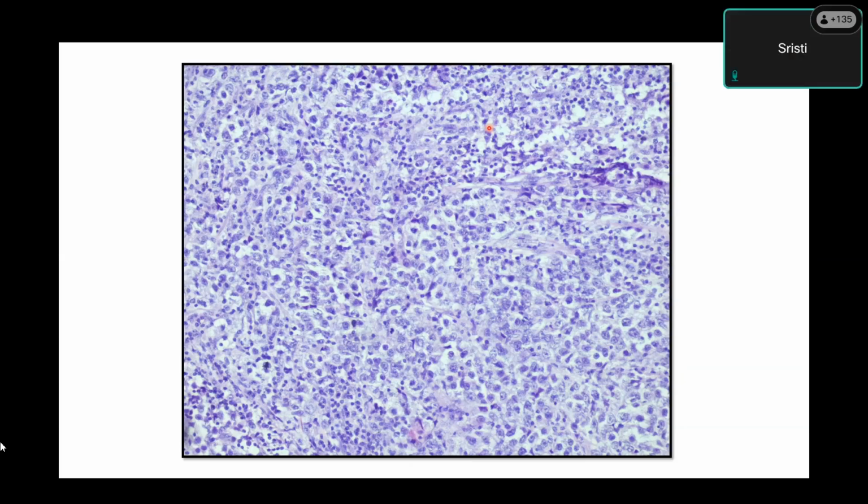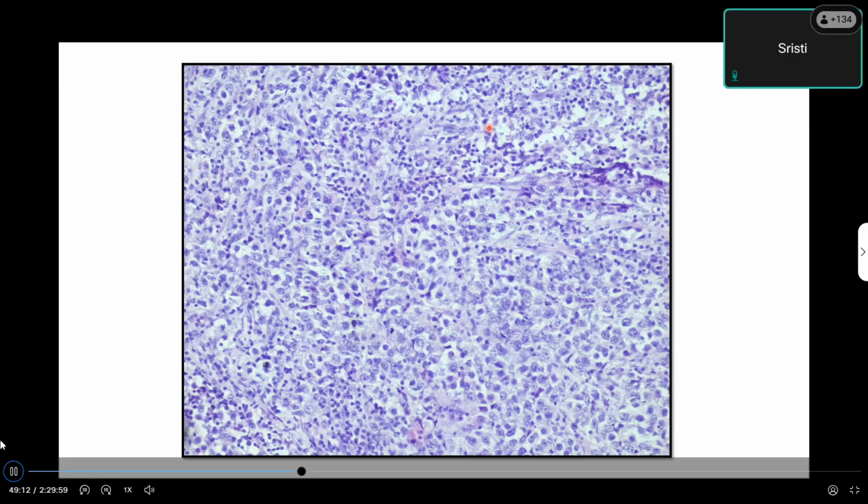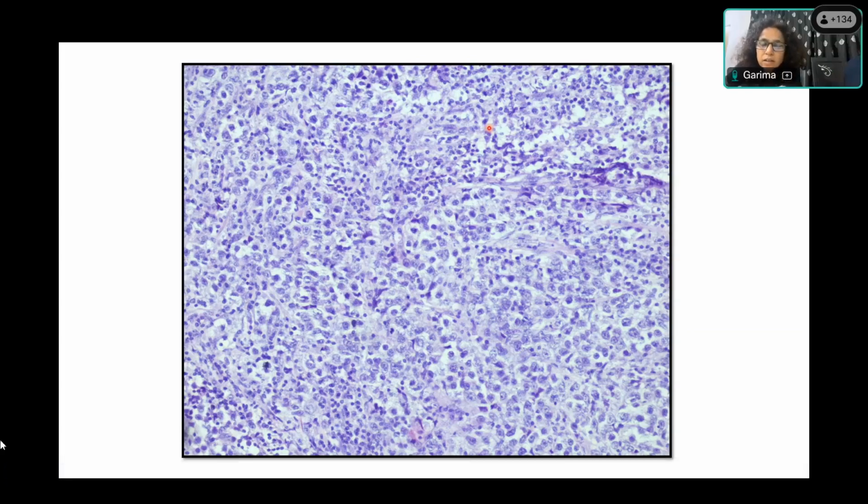Then? And we can see centrally placed nucleus, ma'am. Prominent nucleoli can also be appreciated in most of the cells. Okay. Any other feature which is striking? What is the arrangement of these cells? You've described the cells nicely, but what is the arrangement? They're nested. Lobules, sheets, which are separated by fibrous septae, ma'am. And anything in these fibrous septae do you see? There is lymphocytic infiltration, ma'am.